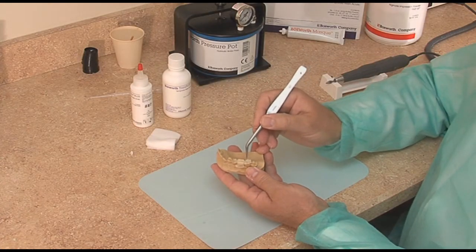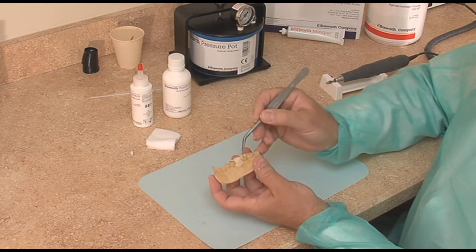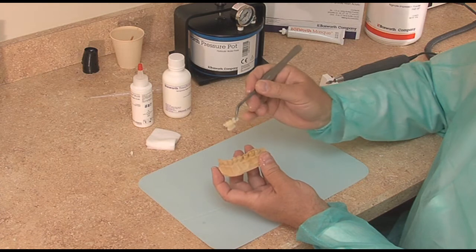The occlusion is going to be a little off, probably because it overflowed. And now this is getting nice and firm and we're able to pick it up.